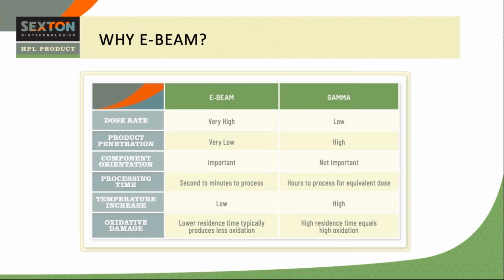Both E-beam and gamma radiation are well-established methods to reduce infectivity of pathogens within a product. Whilst we initially evaluated gamma since it's widely used within the cell culture landscape, we found that using direct gamma radiation had a negative effect on the performance of our product with regards to its ability to support cell expansion. So we decided to move forward with a development project focused around E-beam.